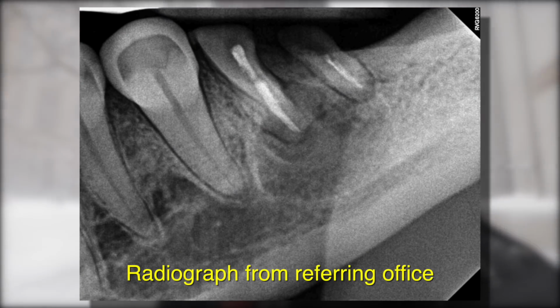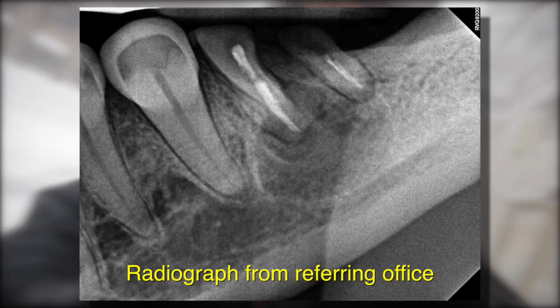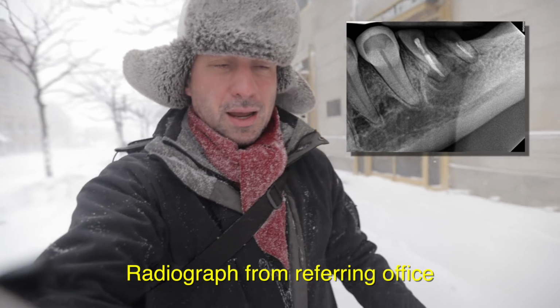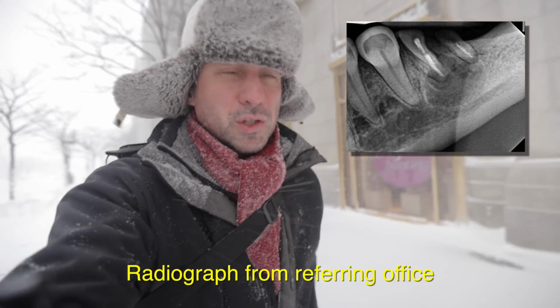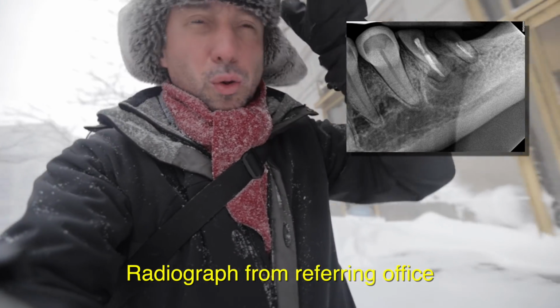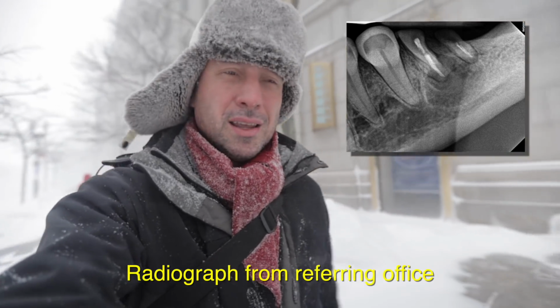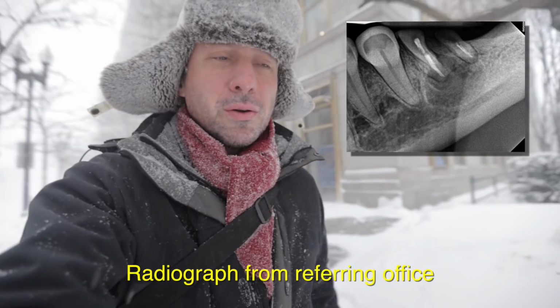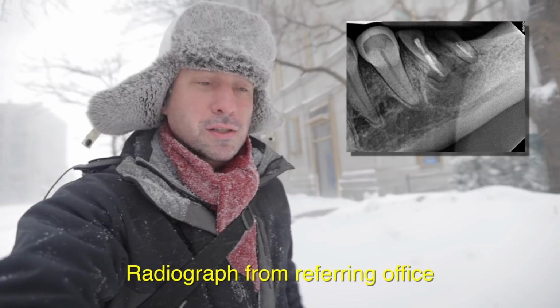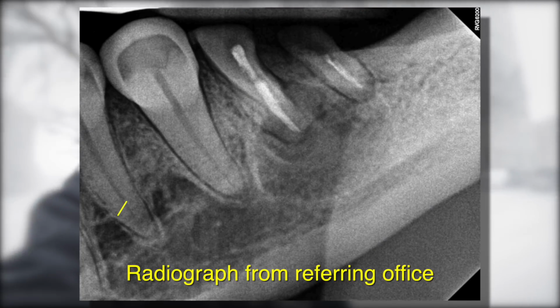So basically, a general dentist had diagnosed the second premolar as necrotic. There was obviously a previous root canal that had been done on the molar, which, due to the patient's neglect, had not been restored and had decayed all the way down to the gum line. So this tooth was not salvageable, obviously, but according to the initial diagnosis by the patient's general dentist, it was not the source of the pain, and the acute pain was coming from the premolar.